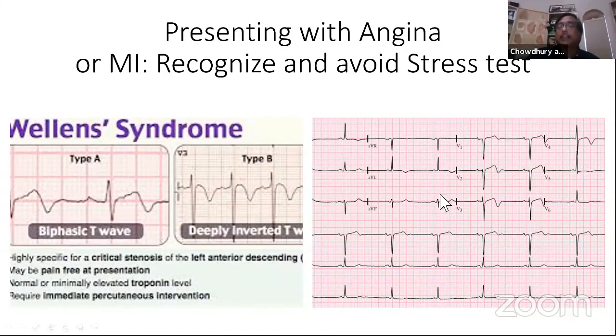But this EKG pattern biphasic, I tell the fellows, I don't care what you call this, STEMI or you call it non-STEMI, but this patient has proximal LAD. One important thing, this patient comes to you or to the hospital, do not do any stress testing on these patients. And you will see them troponin positive. You have to recognize that this is ugly with the biphasic T wave.